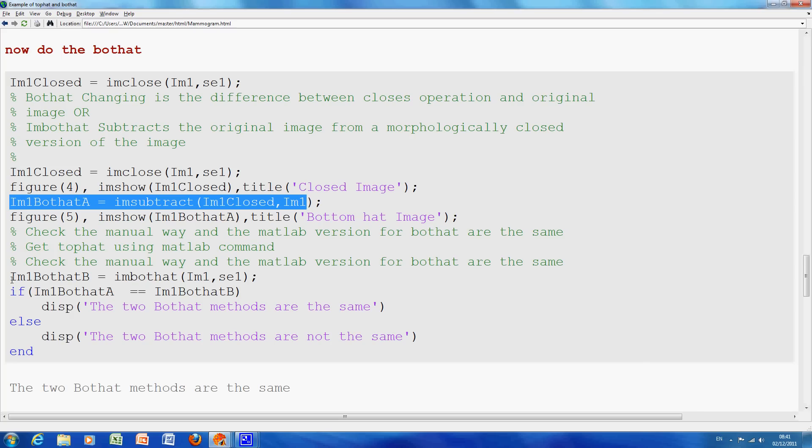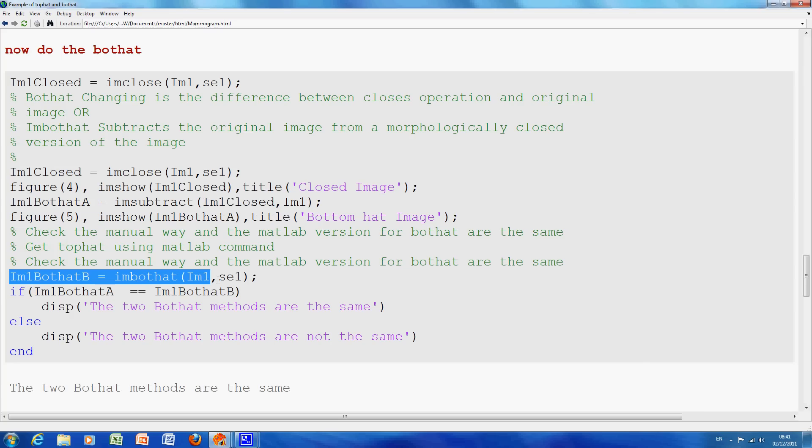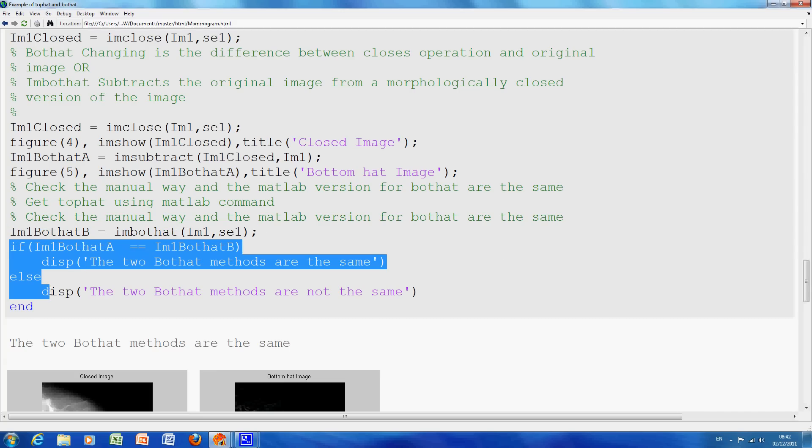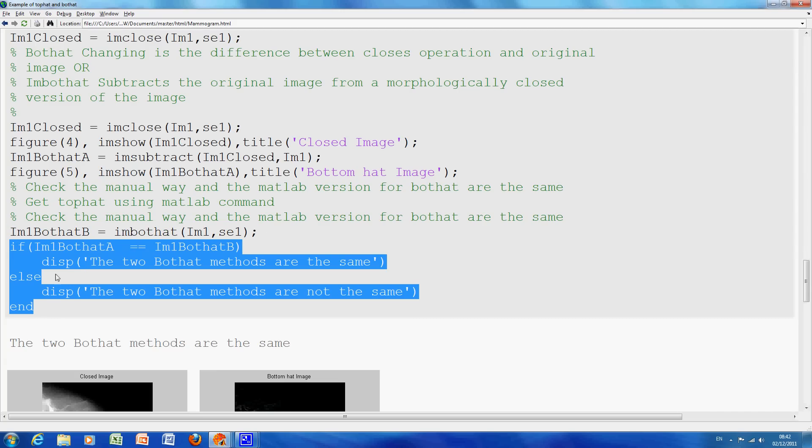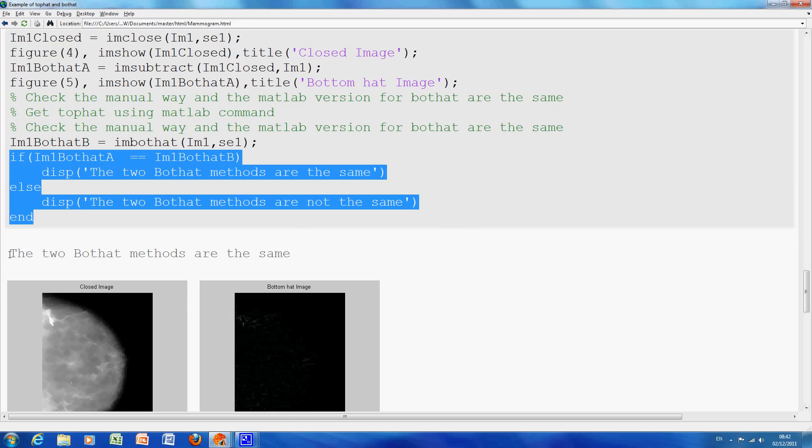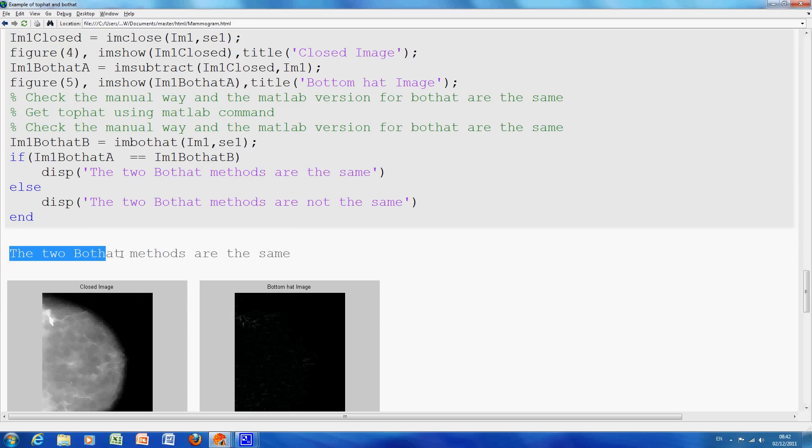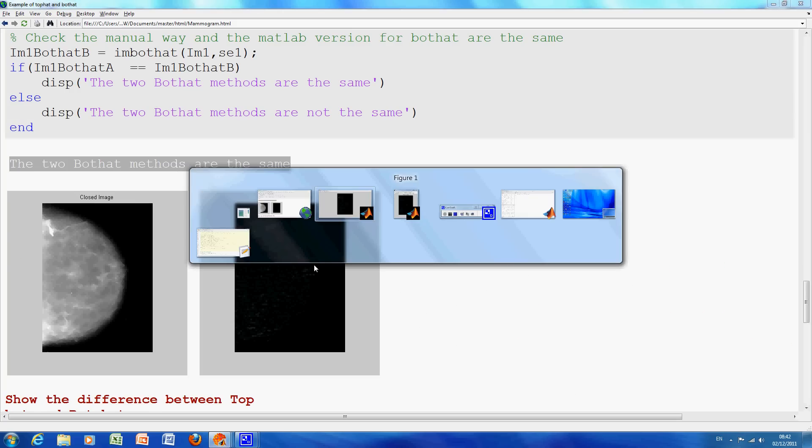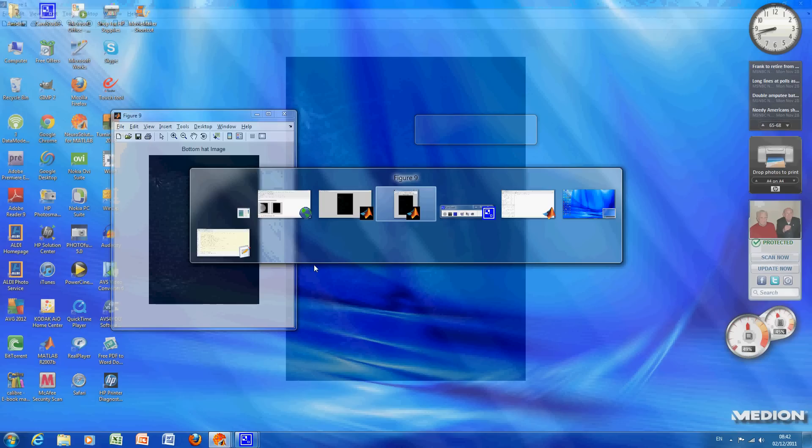Now, before we just look at the two there, I just used the MATLAB function itself, IMBotHat. Did a little test for equality just to make sure the two methods were the same. There's the result. The two methods are the same. And there's the closed image. And there's the BotHat image.